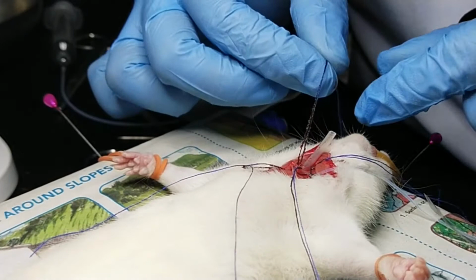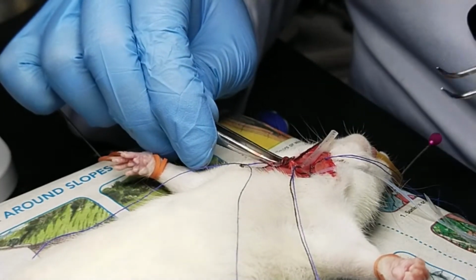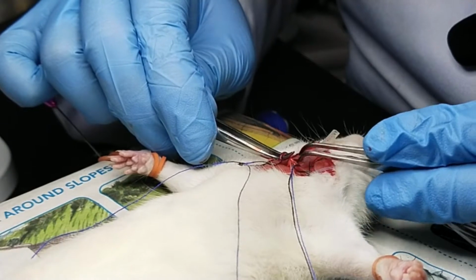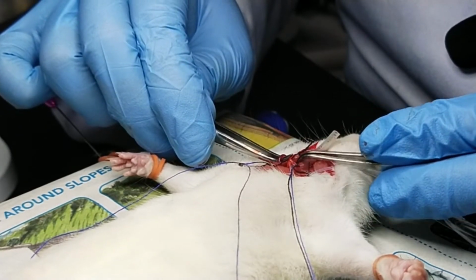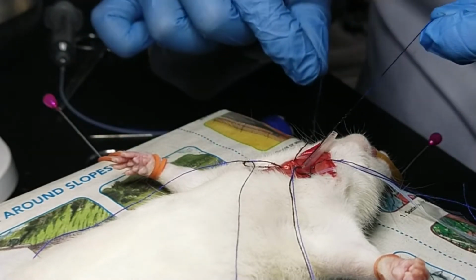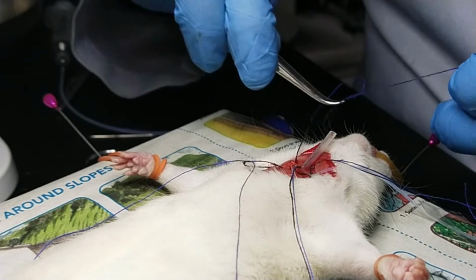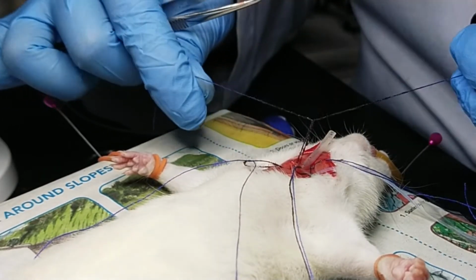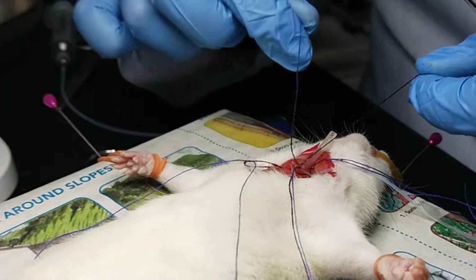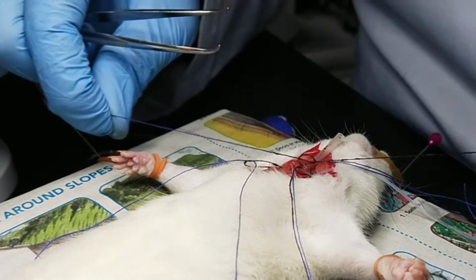The one at the bottom, I'm going to tie. One end is closed.